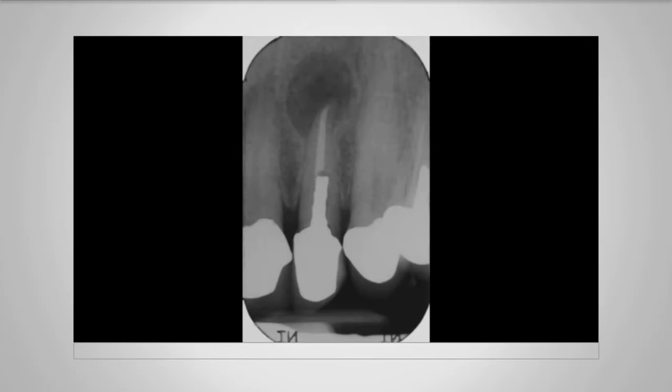and clean that space, and then fill it with IRM or MTA. So this is a typical kind of surgical case. I've got a post crown on there. These crowns actually look really nice, and the patient didn't want this dismantled in order to carry out non-surgical root canal retreatment, but there is a large lesion on there, and so this is amenable to a surgical approach.